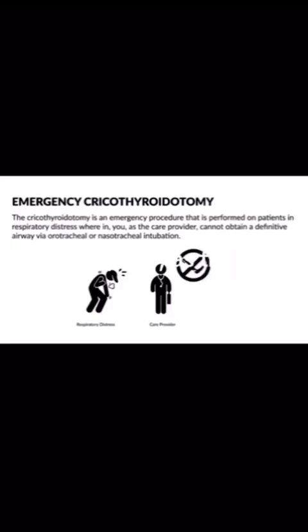This is an emergency procedure that is performed on patients in respiratory distress wherein you, as the care provider, cannot obtain a definitive airway via orotracheal or nasotracheal intubation. This is known as the can't intubate and can't oxygenate scenario.